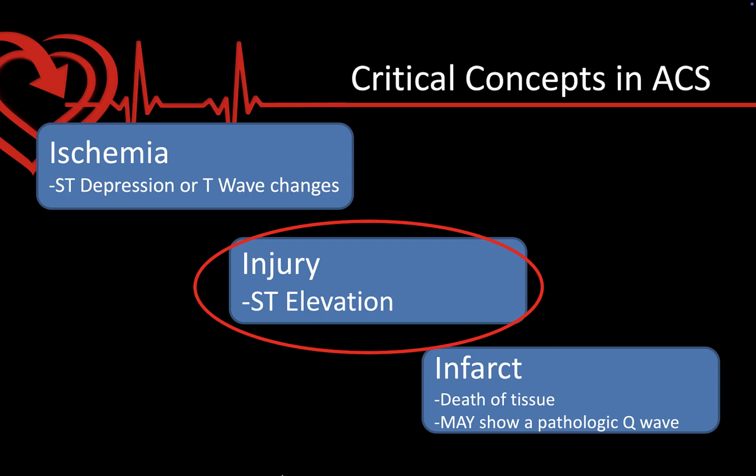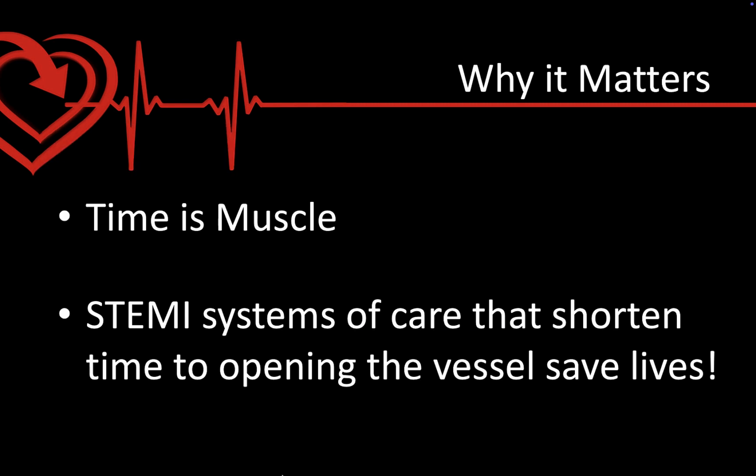Our focus in 12 lead interpretation is identifying ST elevation myocardial infarction, and it probably should be labeled ST elevation myocardial injury because that's when we really hope to catch it, at that injury stage before that permanent damage has happened. Couple key concepts.